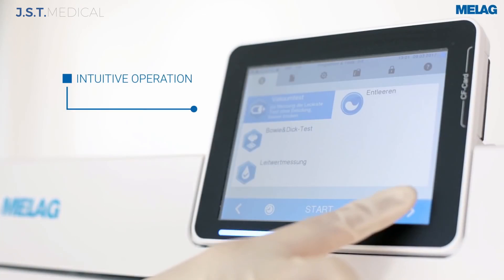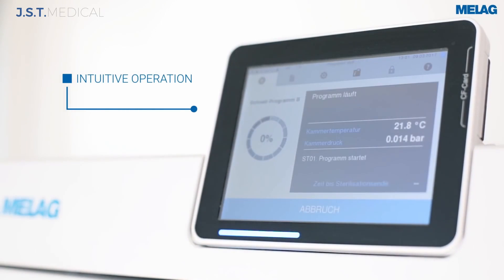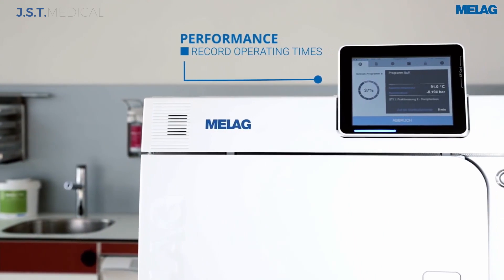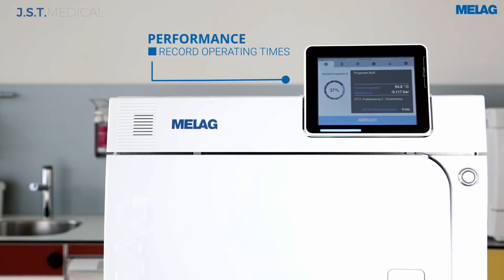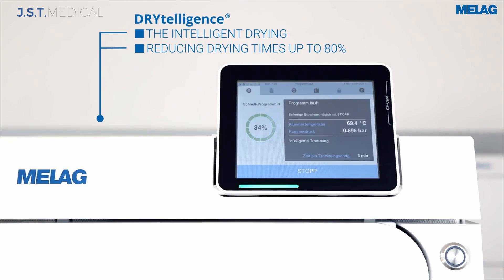The large touchscreen has intuitive, easy-to-navigate menus. The record fast cycle times are due to Miele's intelligent drying system. The unit detects if there is moisture in the chamber and will shorten or lengthen the drying cycle accordingly.